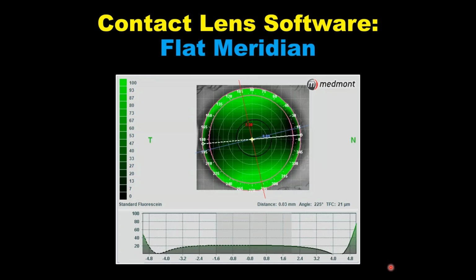So if we take the same patient and place a rigid spherical corneal GP lens on eye, where do you think the contact lens will hit? And of course, you know intuitively that a rigid contact lens will always bear on the flattest meridian of the eye. So we could just go back to the K readings and look at the flat axis.